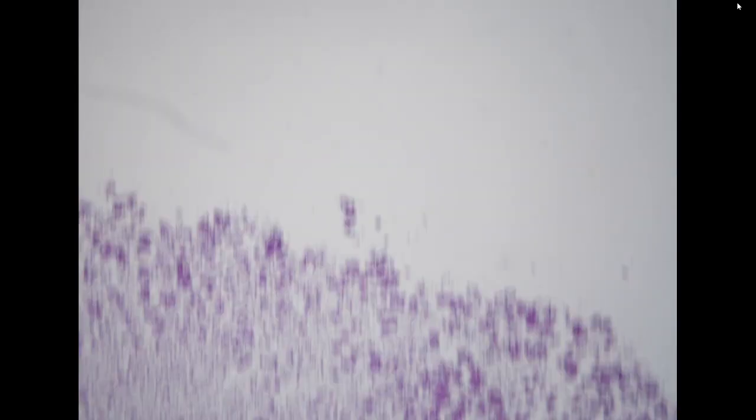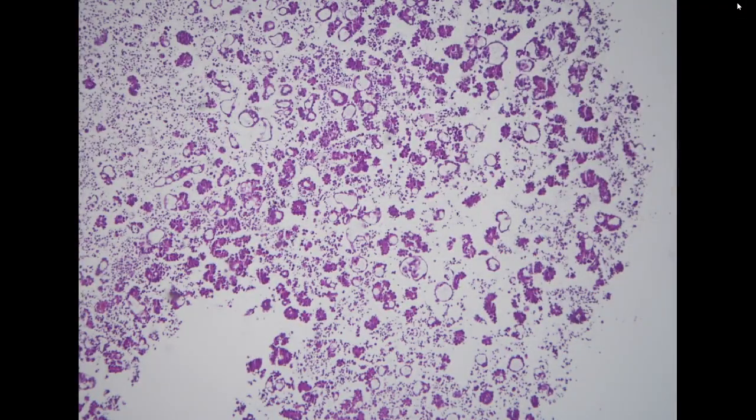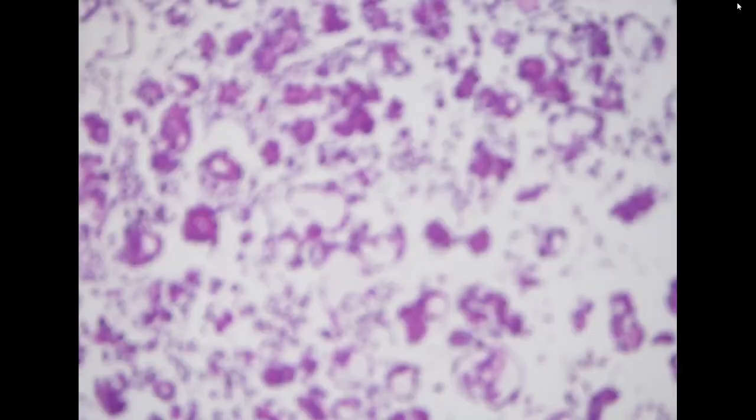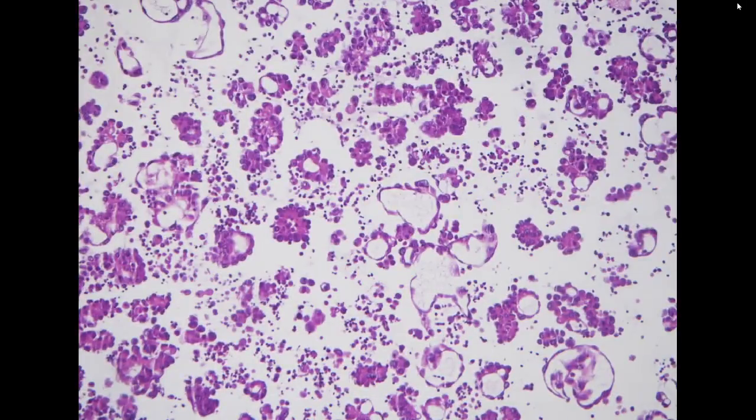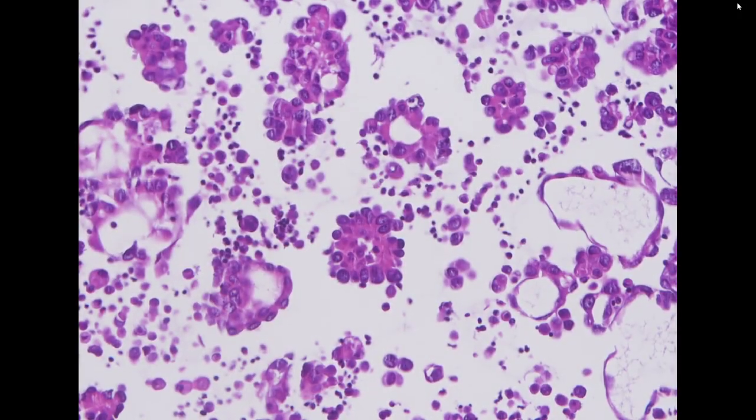for adenocarcinoma. And because this is her very first specimen, we will do a TTF1 on the cell block preparation. The cell block itself is also very typical for primary adenocarcinoma. We see a lot of these glandular structures, and they show prominent hobnailing at the edge of the cellular cluster.